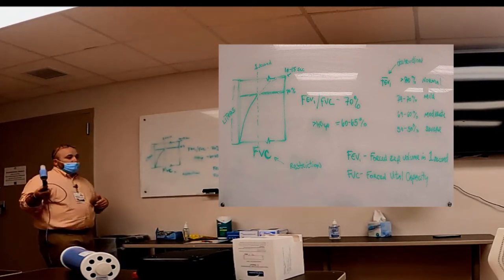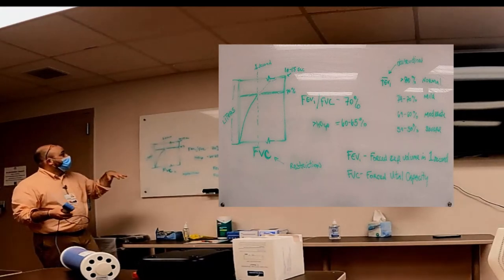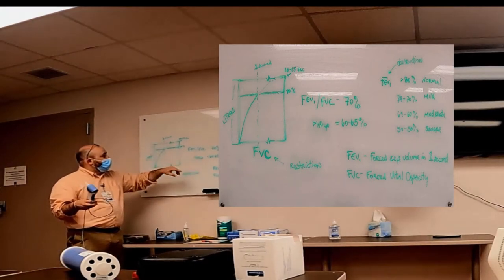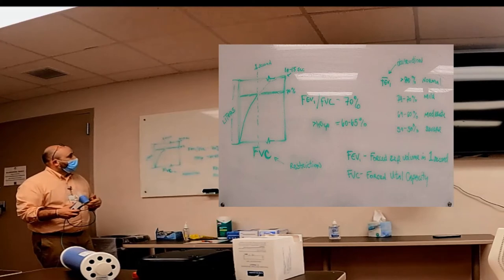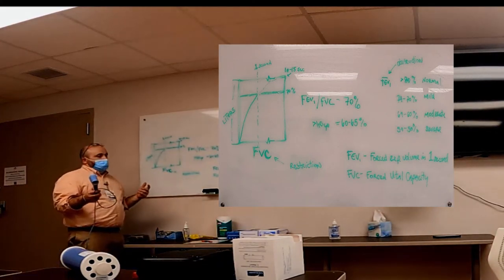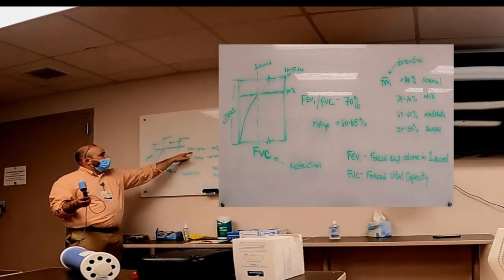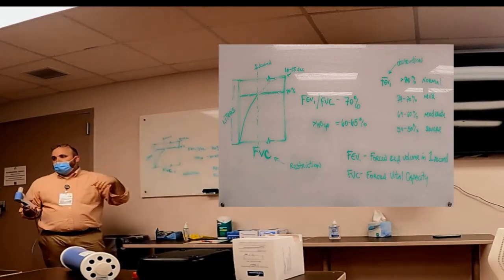So in this case, let's say your FVC is great, your FEV1's low, and it calculates the ratio for you, and your ratio is 50%. So you could only get, of your FVC, only 50% of it was FEV1. Well, that's not good, right?